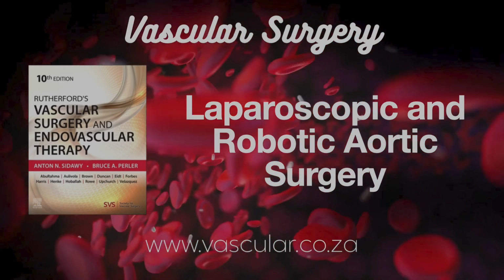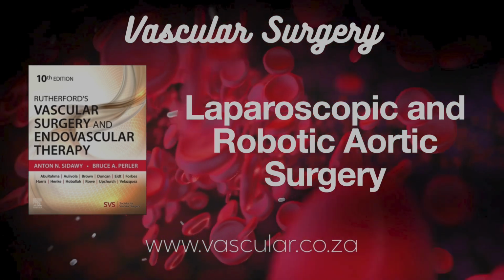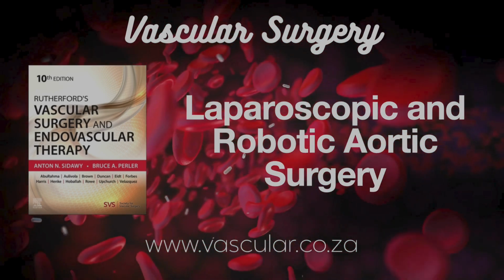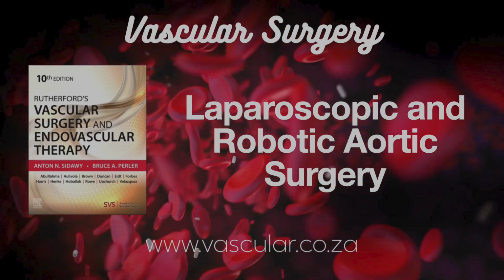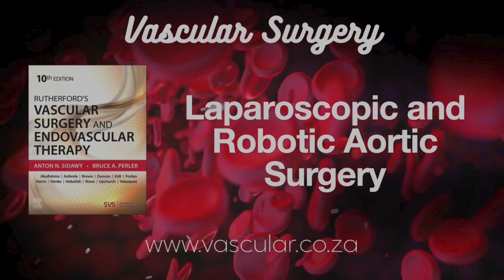Liberal conversion criteria. Exactly. But its ultimate place, its long-term value compared to other options, that still needs defining. They strongly emphasize the need for those large, multi-center randomized trials to really prove the benefit for specific patients who aren't candidates for endovascular repair. More robust evidence is the key message.